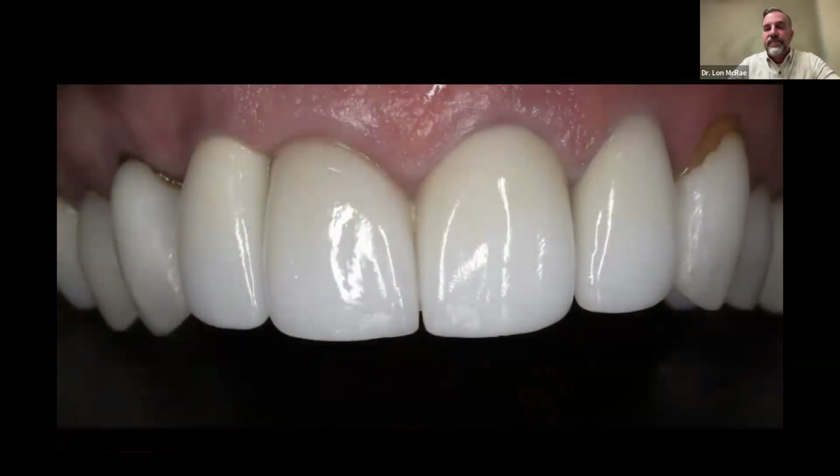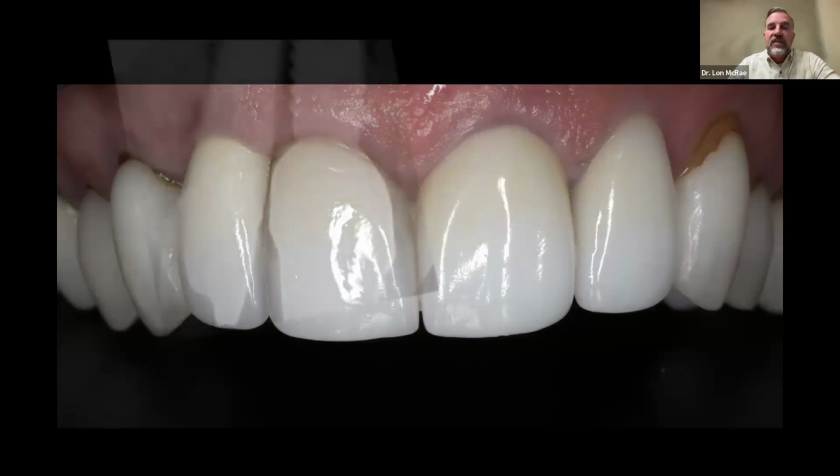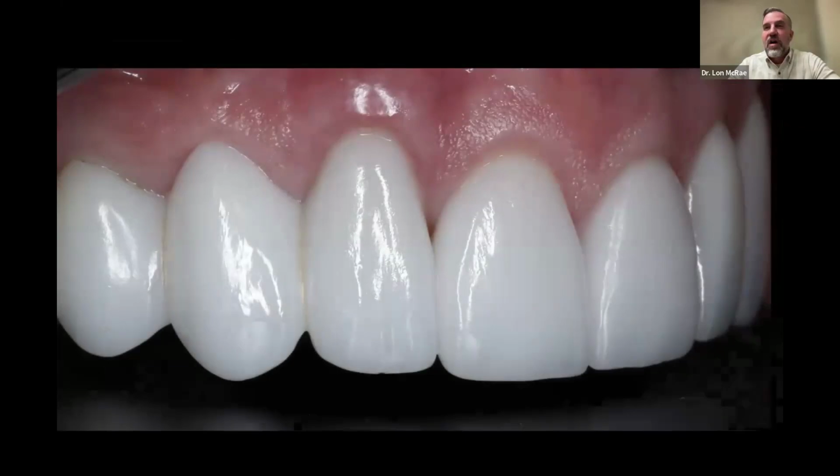This is a little bit harder. Which one did you say on this one? Which was the implant? Was it 7, 8, 9, 10? It's actually, there's two implants here. There's an old implant on tooth number 7, and the all-in system was done on tooth number 9 with a partial extraction therapy that I'm going to show next week, and how we do it with a socket shield. And we have a guide to help do the socket shield that makes it so much easier. In my opinion, it's one of the hardest things to do very well, is a really good socket shield.